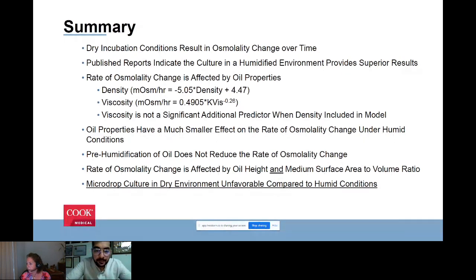Yeah. Okay, so EmbryoScope is a dry incubator. Well, they're coming out with the humidified EmbryoScope. So yes, I do agree that they say that it produces better embryos, but even they are now moving to a humidified EmbryoScope. So there must be a reason that they moved to the humidified version, which, if anyone knows the name, obviously I don't work with Vitrolife, but I think it's EmbryoScope Plus or something along those lines, is a humidified incubator. And again, I do also believe that not moving the embryos, leaving them in place, has an advantage. Yeah. So probably that's my best answer to that question.